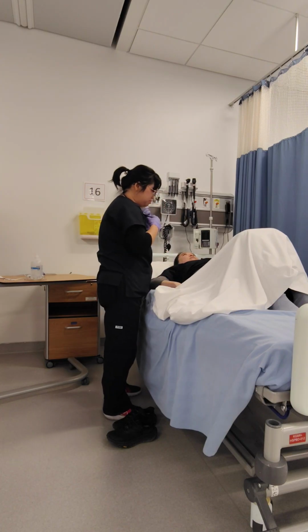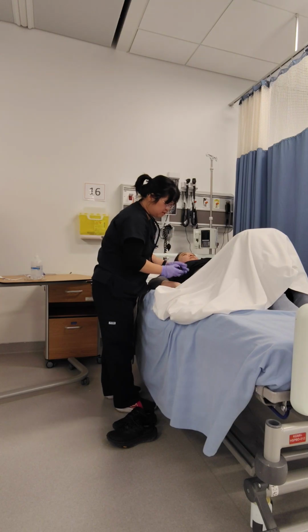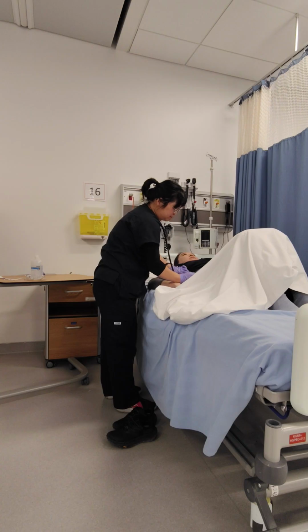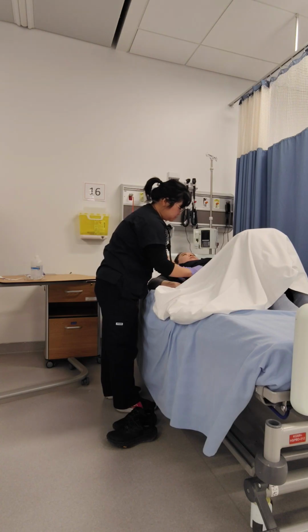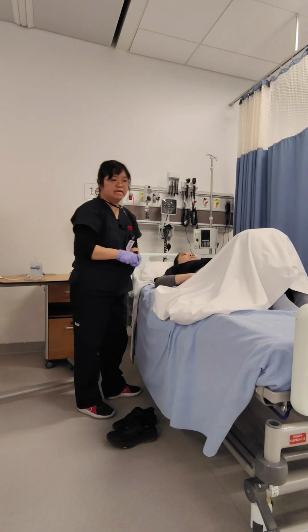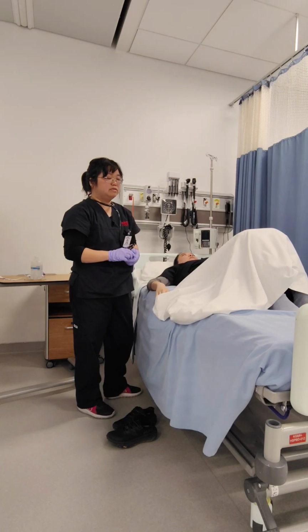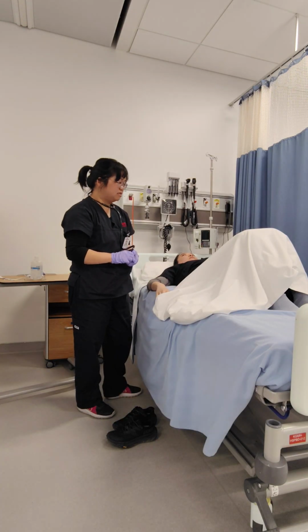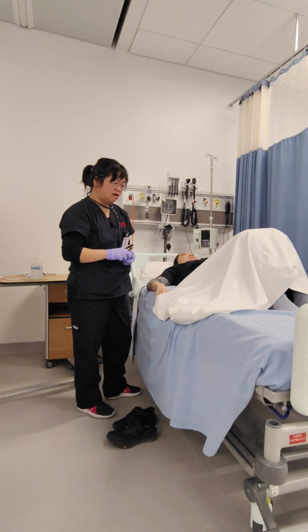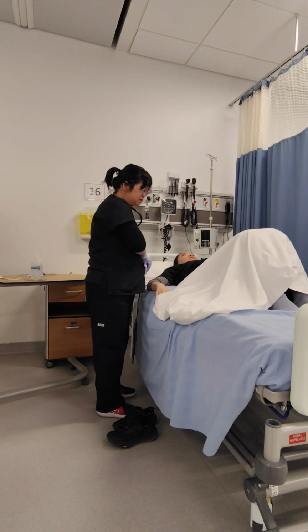Next, I'm going to auscultate the 4 quadrants, starting from the right lower quadrant clockwise. So in all 4 quadrants, I can hear the bowel sounds, about 16 times a minute, high-pitched gurgling cascading sound.